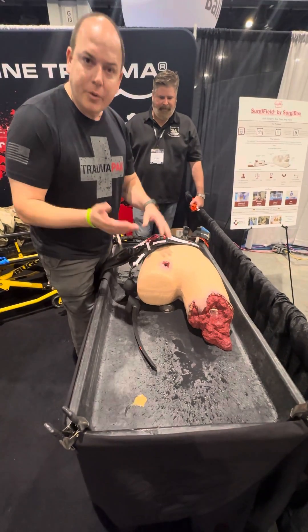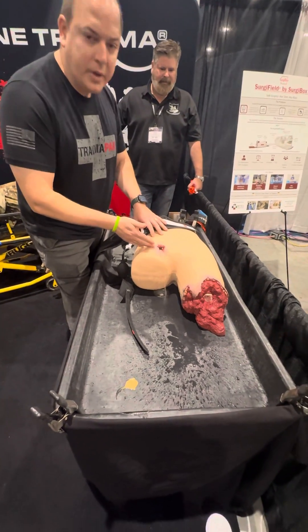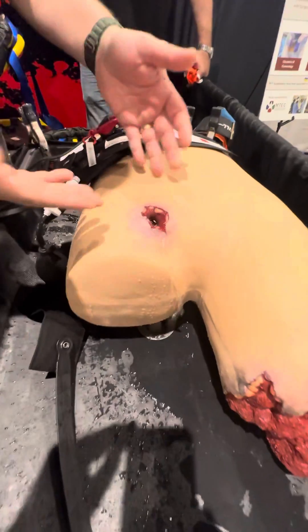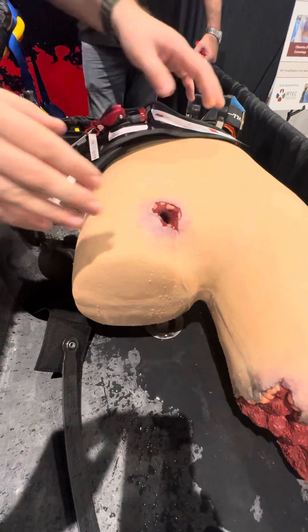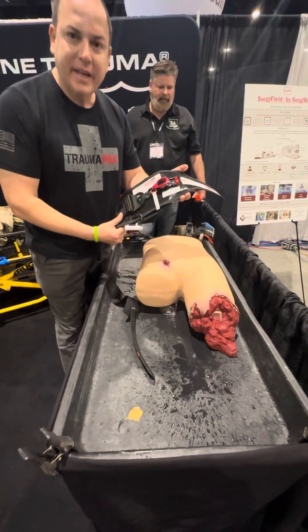I'm going to do this in low speed so we can explain as we go — obviously I'd be moving a lot faster. So we have an uncontrolled pelvic bleed here. We could try traditional wound packing, but I want to really highlight the thickness and the use of the AAJTS.